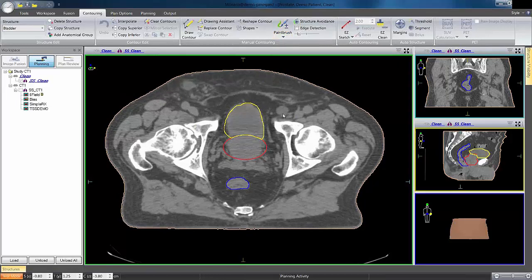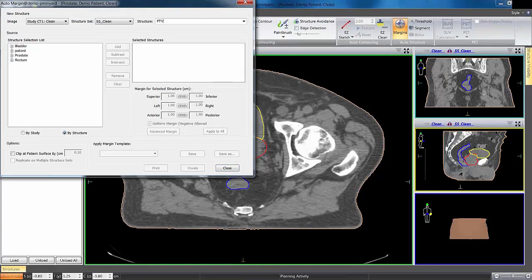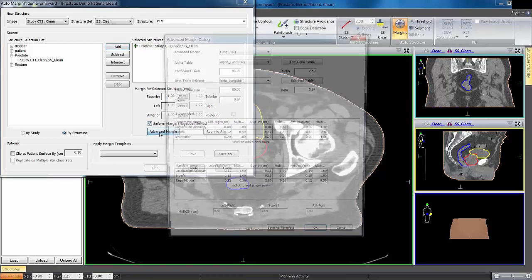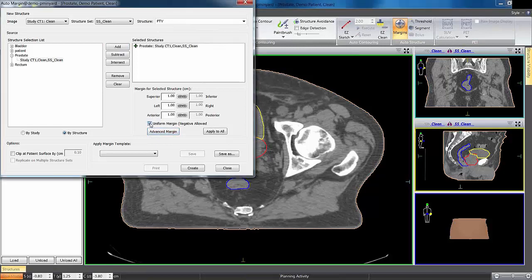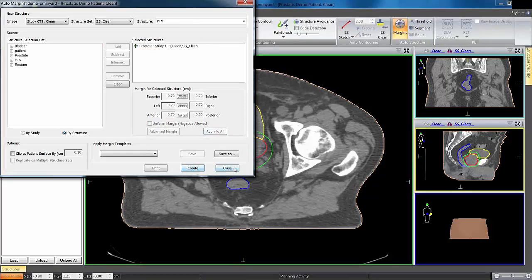The last thing is putting a PTV on here so we can move into planning. Very simple—I'll call it PTV. I'm just going to expand on the prostate. We can put a slightly different margin in each direction: maybe 0.7 on the anterior and 0.5 posteriorly. So now we have a PTV to work off of, and I've quickly contoured my prostate structures.